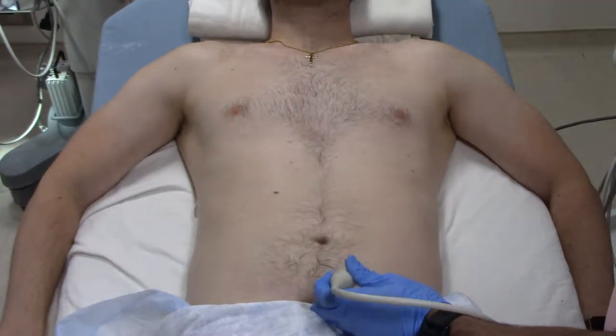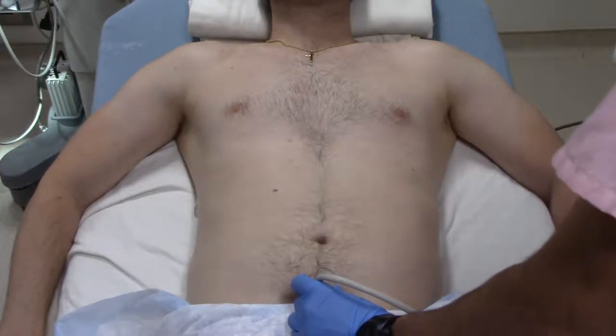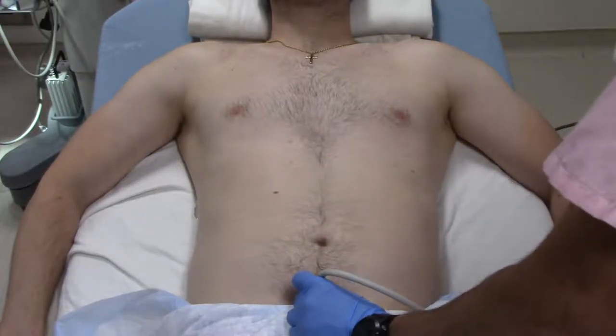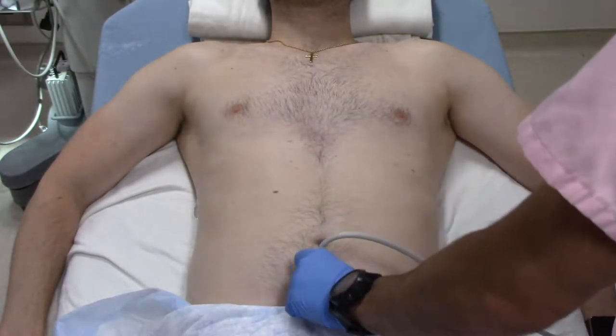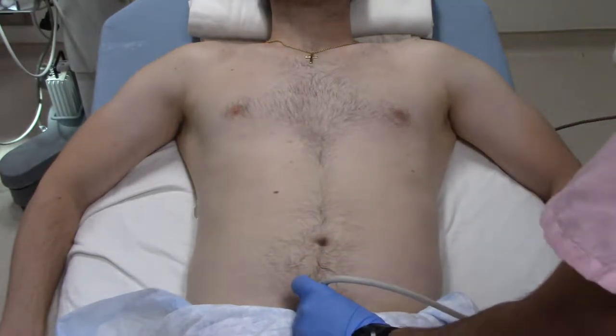Indicator towards the patient's right. We're going to acquire, fan all the way down into the pelvis, all the way back up.